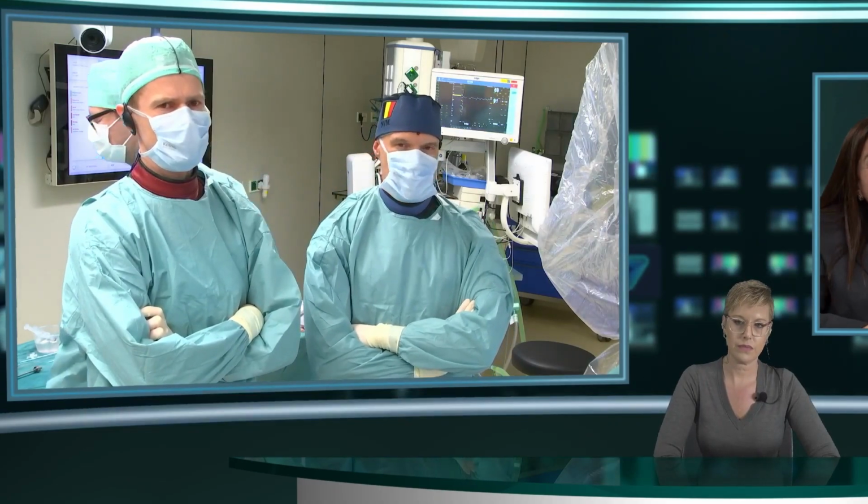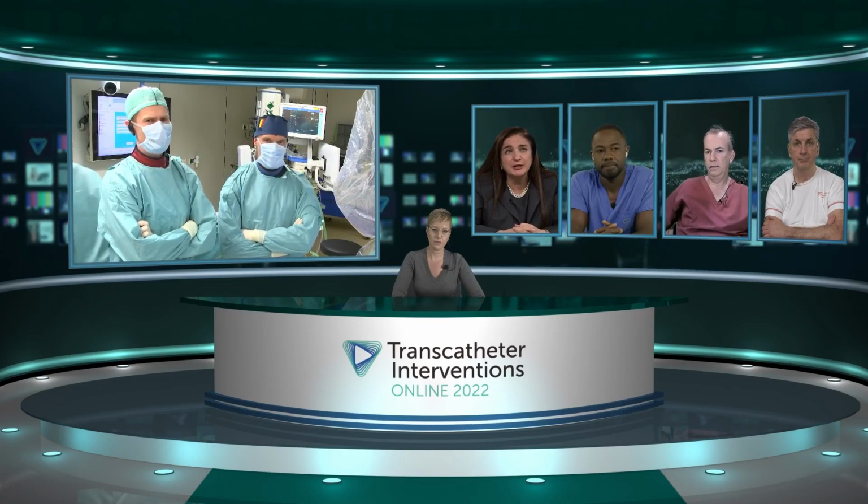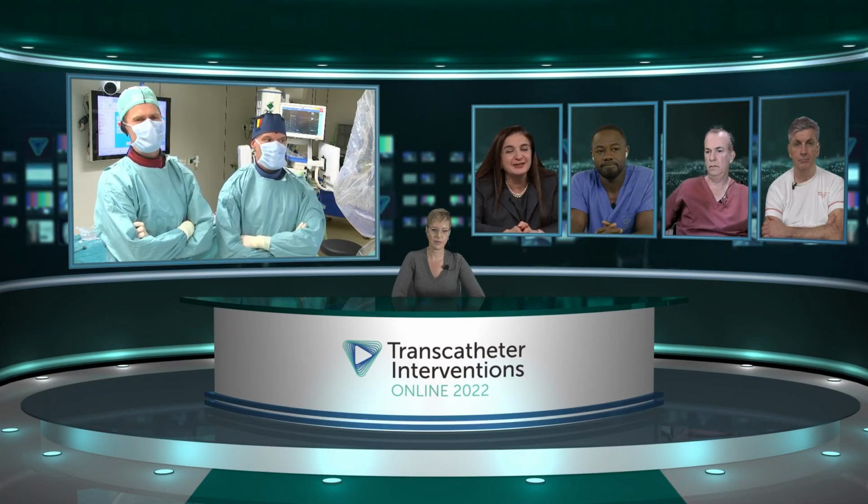Well, really difficult case, and I don't know what you think is the caliber of that right femoral artery, so small that you wouldn't even consider using shockwave to really help you get your devices across. Whatever I could do to do a femoral approach is what I'd like to proceed with, and that's sort of our motto.